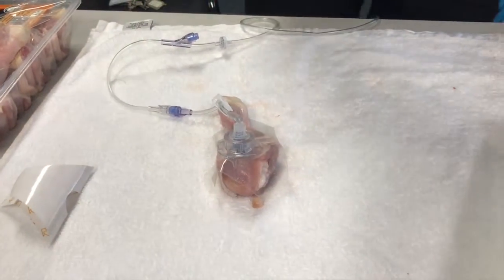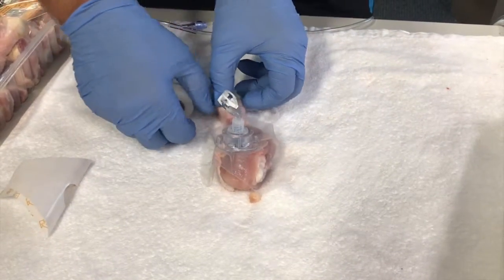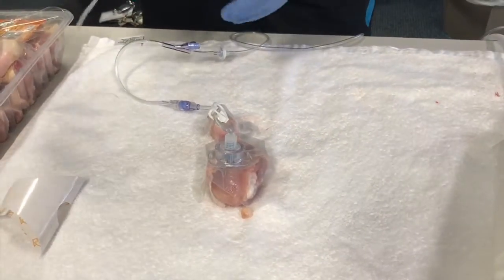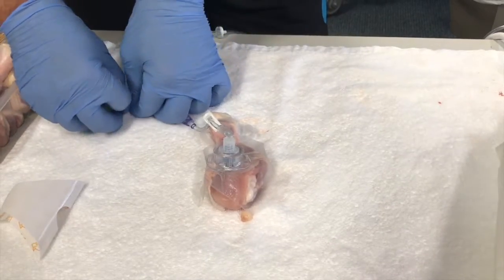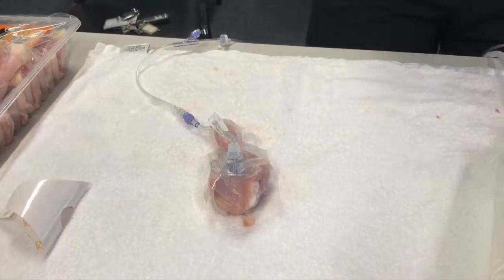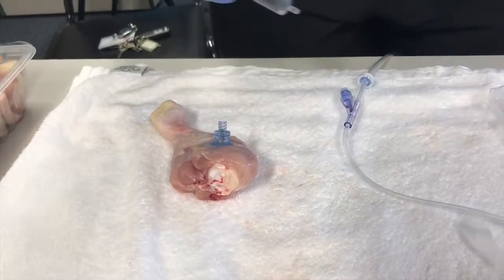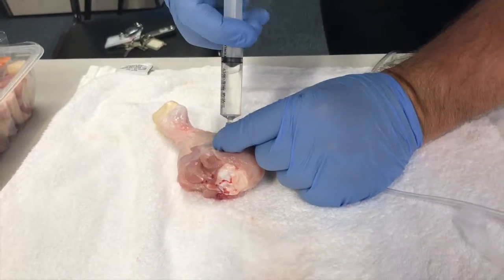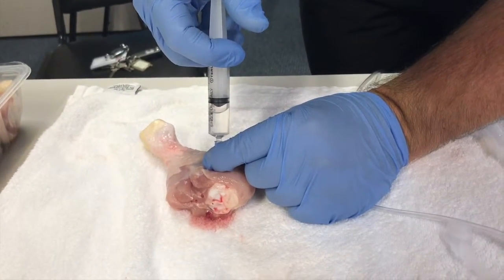Once I've done that, I take the extension tubing to the leg of the human, or the chicken in this instance, and I'll tape down the extension tubing to the leg of the human also. And to show that the needle is in the right place, I can attach my 10 ml syringe with some normal saline here, and I can just flush through, and you can see all the bone marrow coming out through the ends.